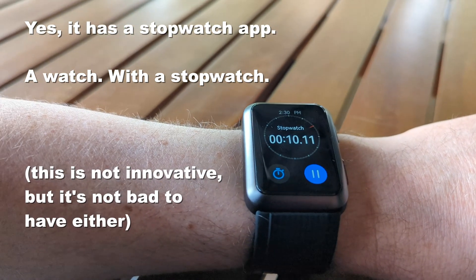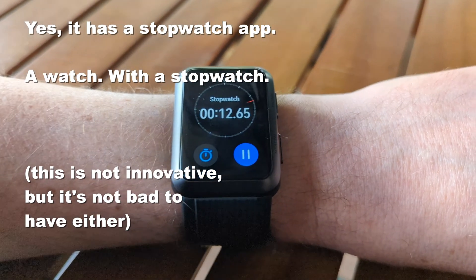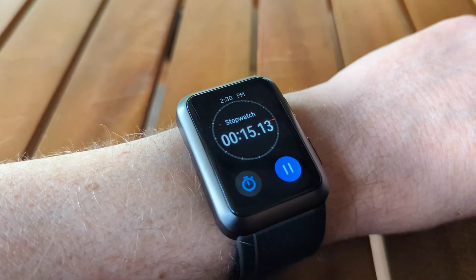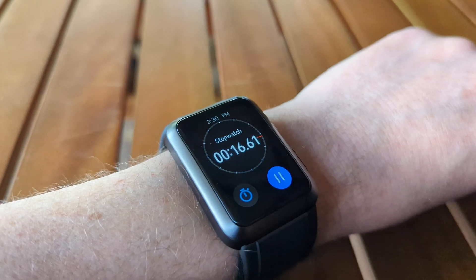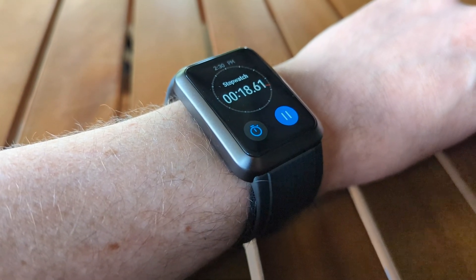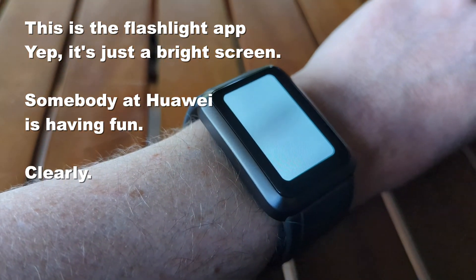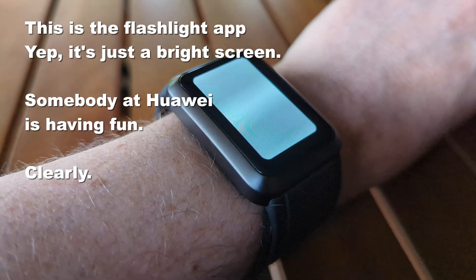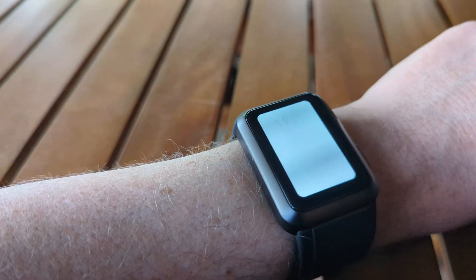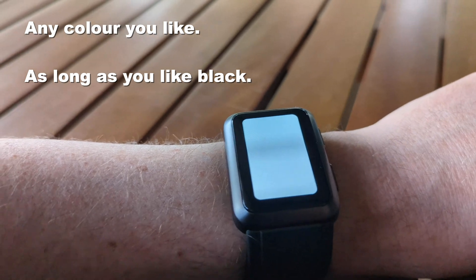The Watch D does all the usual things you'd expect a smartwatch to do — notifications, music playback control, fitness tracking. It's got a bunch of health sensors for things like skin temperature and heart rate and all the stuff you'd expect out of a standard smartwatch. But this is a smartwatch that Huawei wants $799 for, which puts it on the premium side of the fence. So how are they justifying that price? Well, it's certainly not in the design, which is chunky and comes in exactly one color with one band color — black.